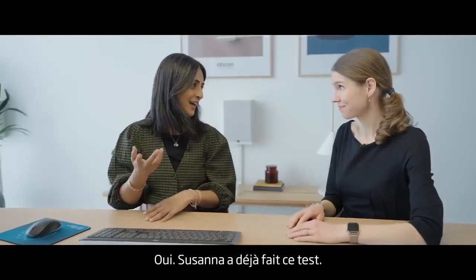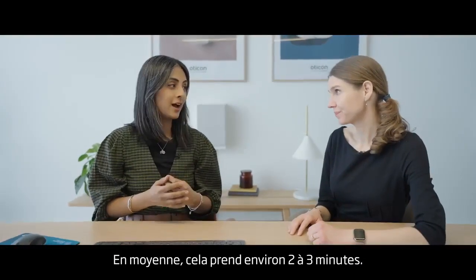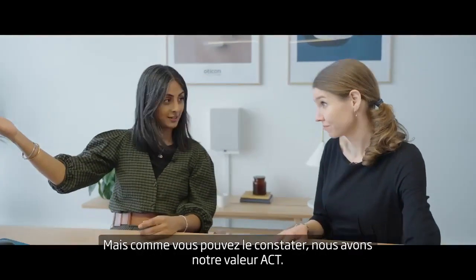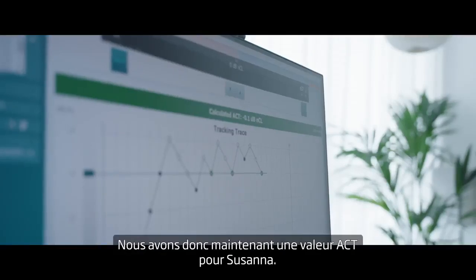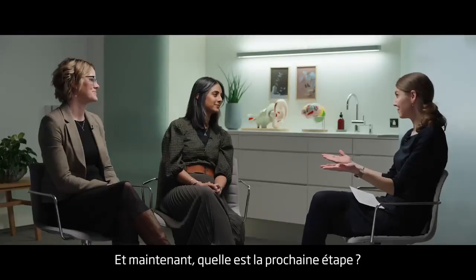Yeah, I mean, Susanna has done this test before. On average, it does take roughly 2 to 3 minutes. But as you can see, we have our ACT value. So now we have an ACT value for Susanna. Yeah. Now what? What's the next step?